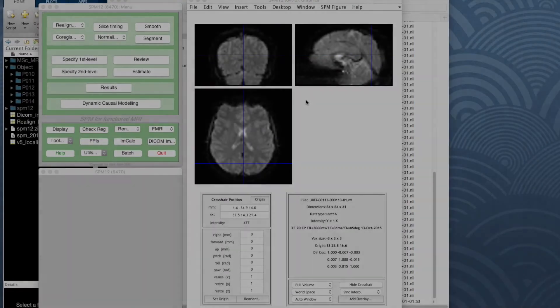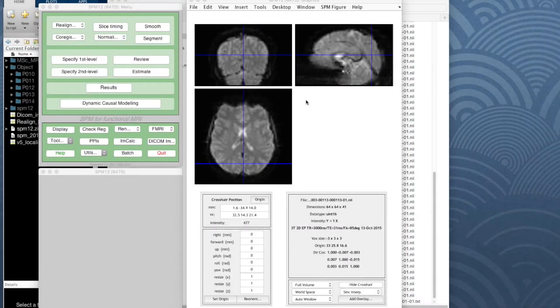The next step is to normalize the images — changing their shapes so they match a template or normal image — and this involves quite a clever three-dimensional warping. The realignment we did was very simple: six-parameter rigid body, where the image didn't change shape at all, it just moved about and rotated. To warp an image to match a template it has to be able to distort in three dimensions in a nonlinear way.